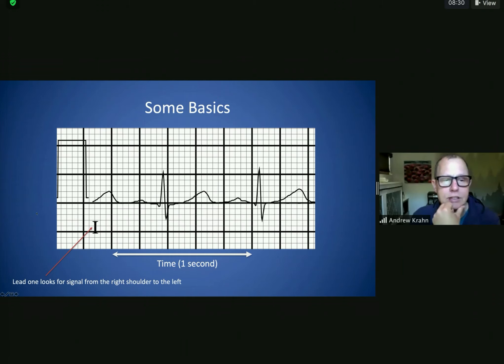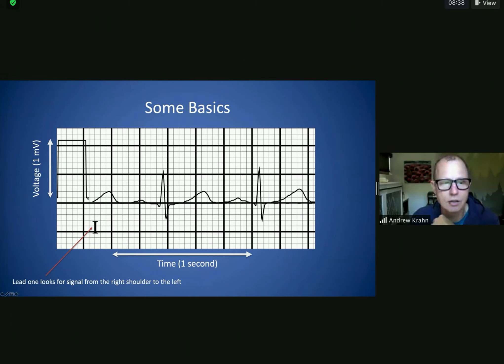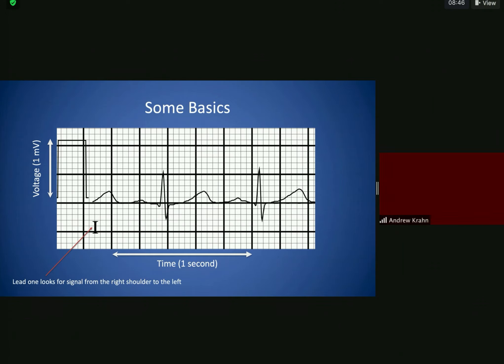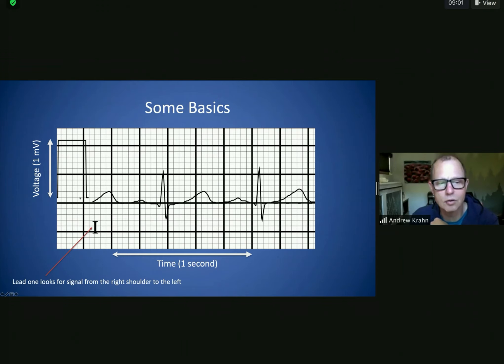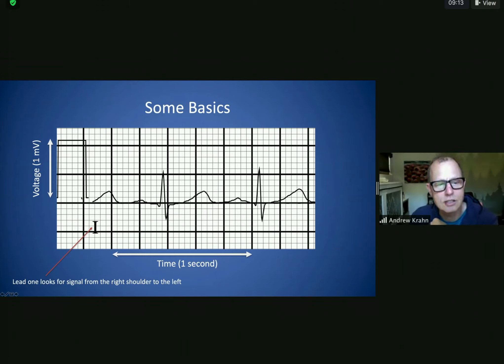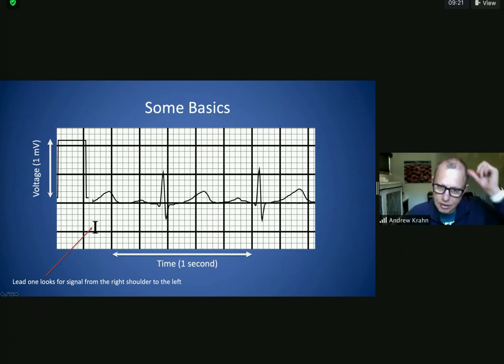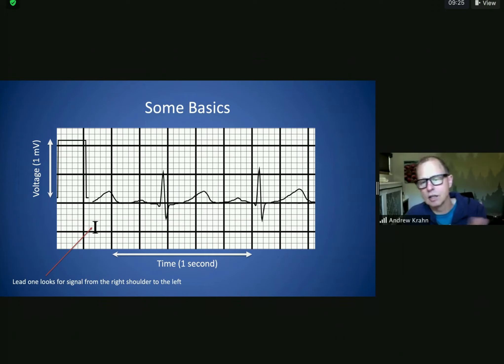The calibration signal appears on all 12-lead ECGs. The y-axis represents the size or amplitude of the signal in millivolts. The calibration signal sends out a one-millivolt signal to ensure the recording is accurate. On the y-axis, each big box is 0.5 millivolts, so two big boxes equal one millivolt. Each tiny box is 0.1 millivolts. Essentially, you're looking at the size of the signal over time as it happens.